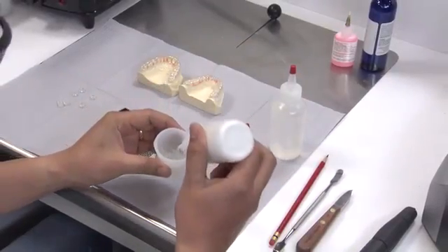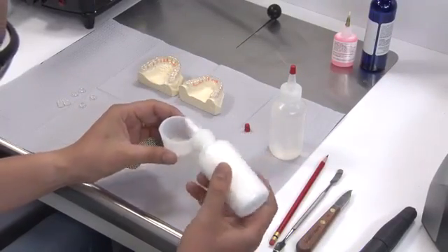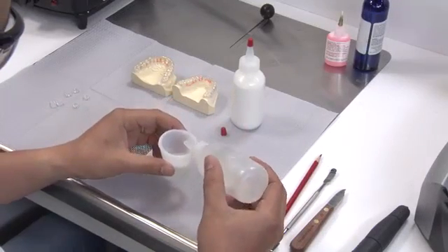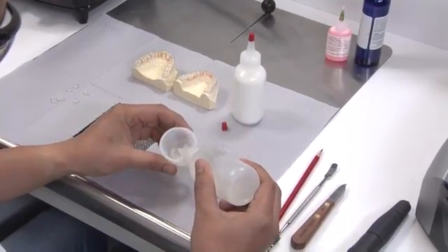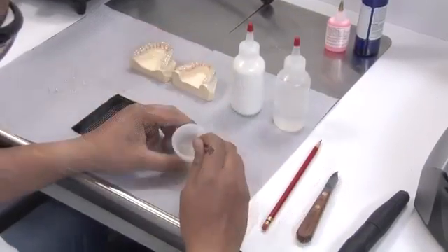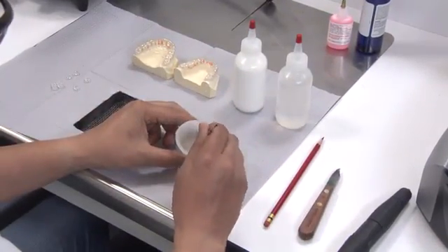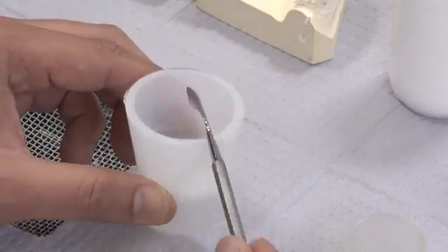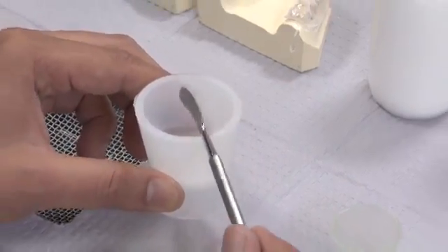To prepare acrylic, add acrylic powder to a mixing cup. Then add monomer liquid. Using a spatula, mix the acrylic thoroughly. The acrylic may be runny at first, so let the mixture set up on the bench until it has reached a doughy state.